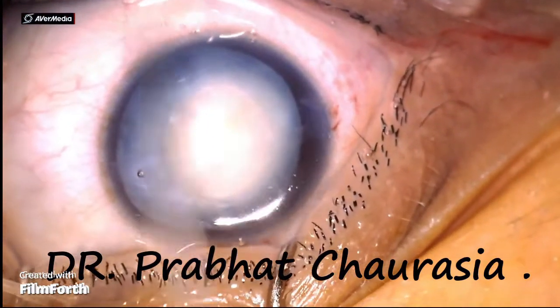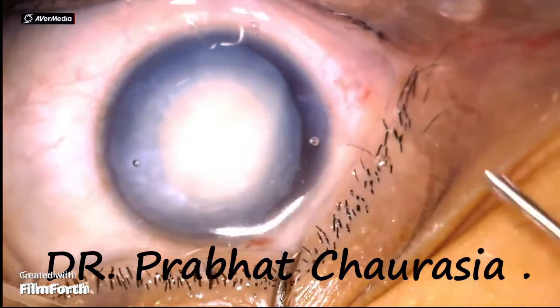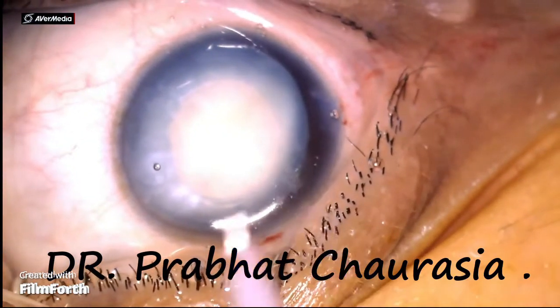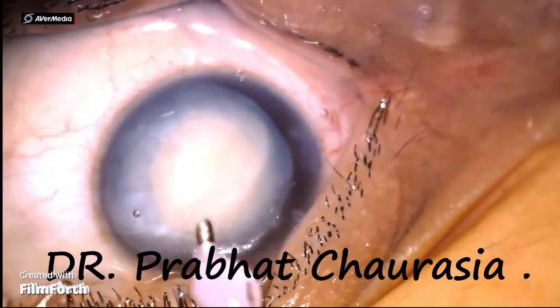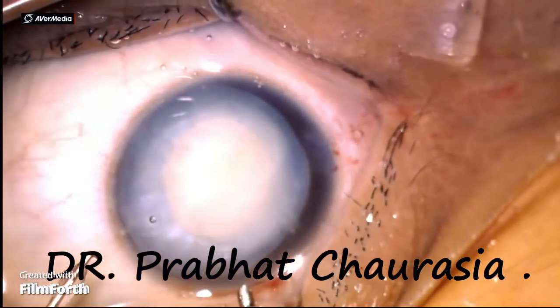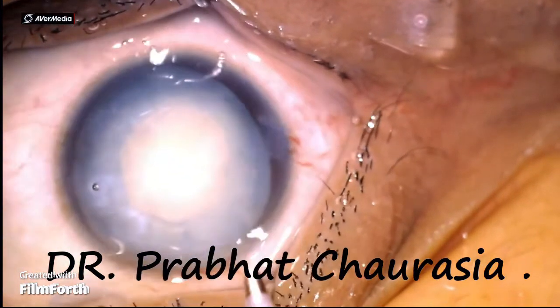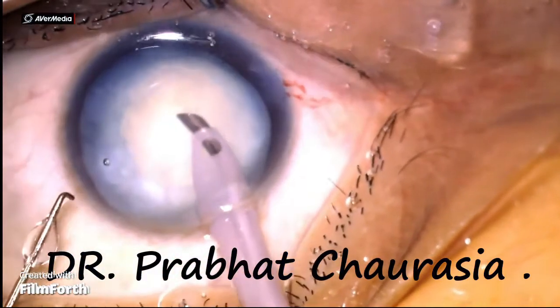Just rotate the nucleus to ensure that there is no cortico-capsular adhesion. Now insert the phaco tip of the phaco needle, and use the left-sided side port for the chopping.